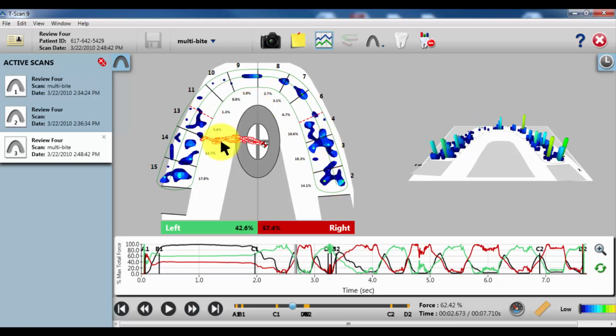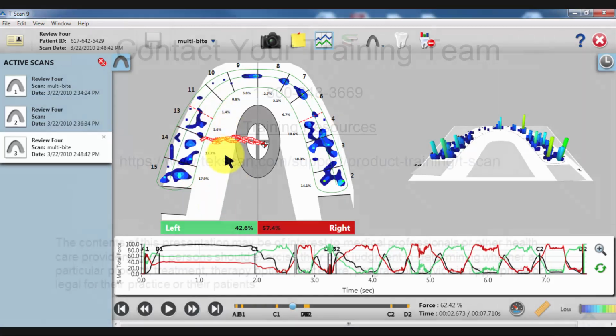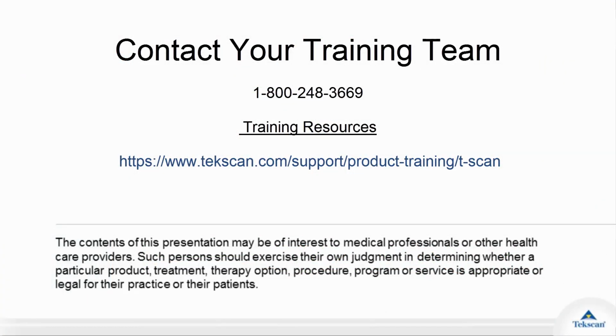Now, one thing to indicate with this movement, though there are higher forces in other places, we're really being specific to the complaint of the patient. And so when the doctor created this, it was really to focus in on a specific area that was of concern for the patient. And so this is a crunch and grind movement.